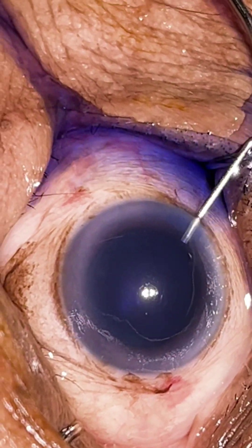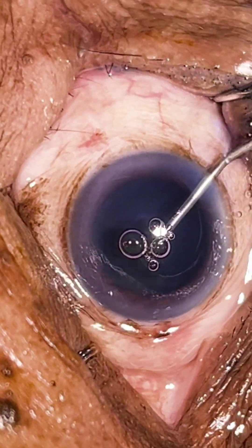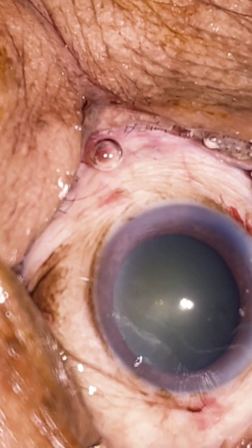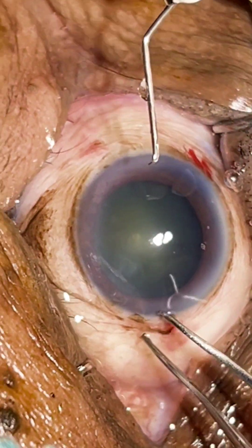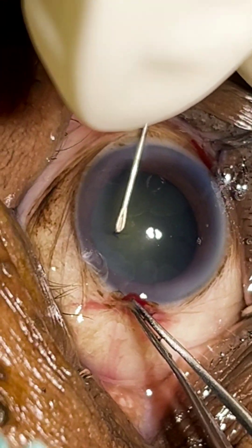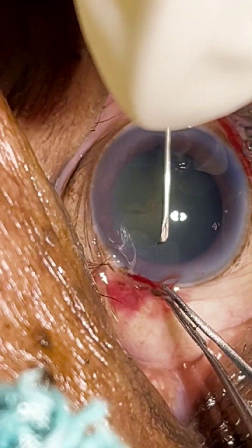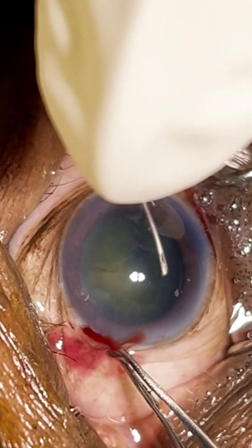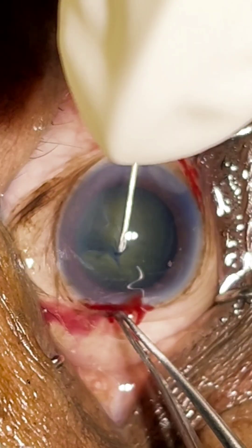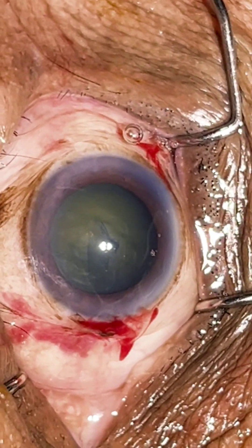Here I did my first two side ports, then the main incision at the limbus. Now we will proceed with rhexis. We usually do a rhexis of 5.5mm — not larger than that and not smaller. If it's a smaller rhexis, it can lead to capsular phimosis syndrome post-op. If it's a larger rhexis, there will be lens tilt and during emulsification it also becomes tough.